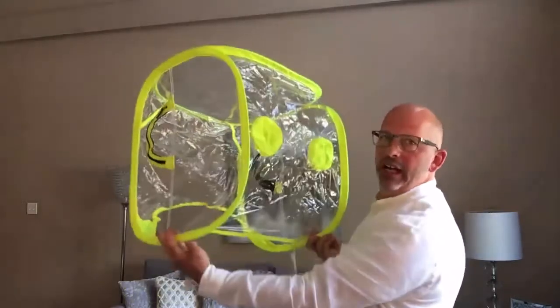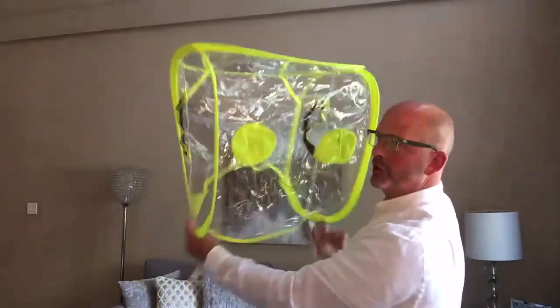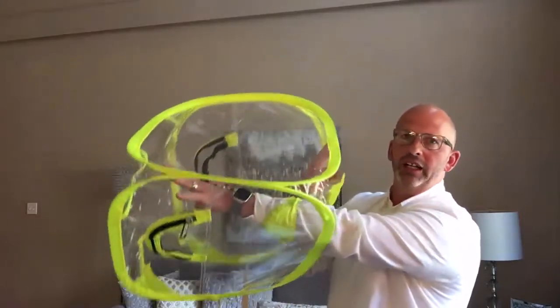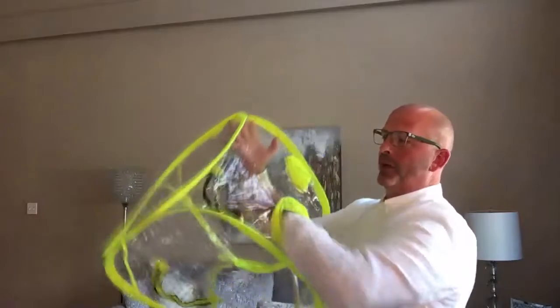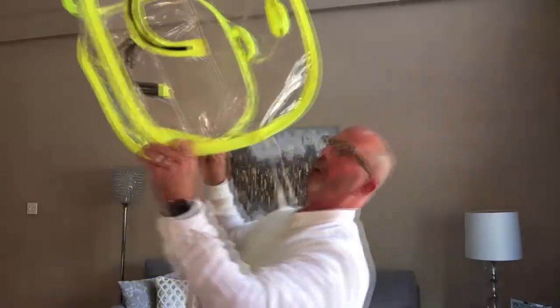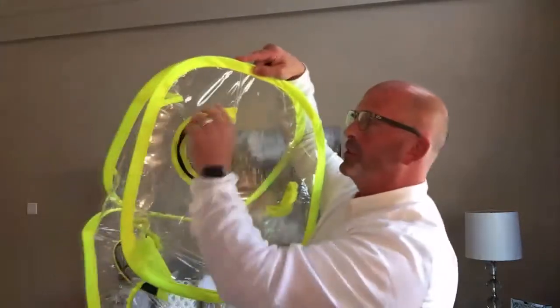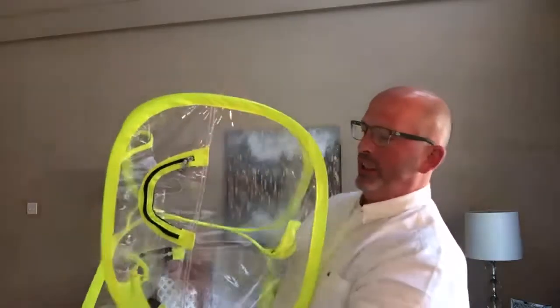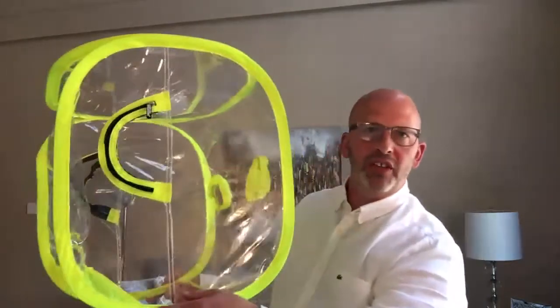See, this side has two arm access holes that an anesthesiologist or doctor or whoever can reach their hand into. You can pick that up on that camera or not. And I'll just show you here. I'll be the lying down patient. Well, it just goes like this, simply over the patient. It has some zippered side access holes for assistance during procedures. It straps down to the table underneath.